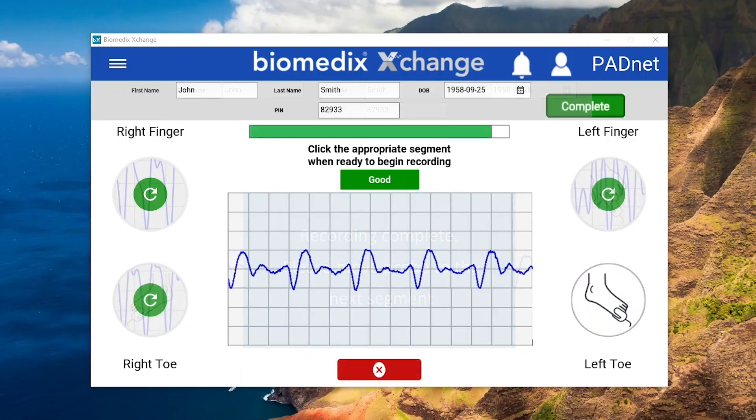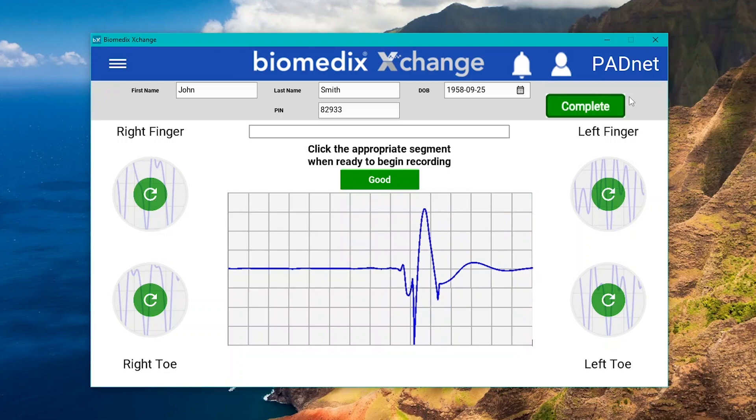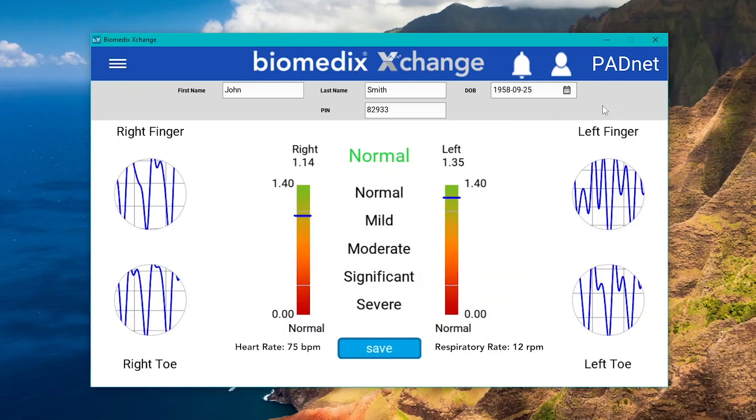Once all segments have been recorded, select the complete button in the top right to finalize the results. On the final screen, you will see the scores for the left and right side, weighted between 0 and 1.4, along with the patient's respiratory and heart rate.